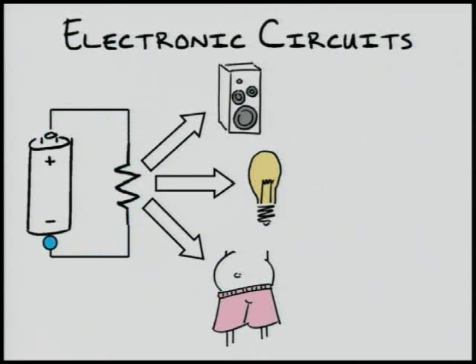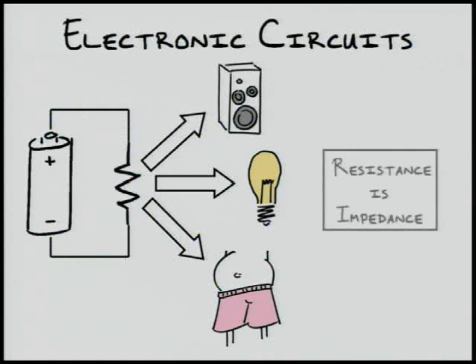The reason being, the charges produced by the neurostimulator must traverse cells or the extracellular space as they exit one electrode of the neurostimulator and enter the other. These pathways are not very conducive to current flow or charge movement and thus resist this phenomenon, which is why they can be considered a resistance or impedance. For the sake of this tutorial, we will use the word impedance rather than resistance to describe this aspect of neurostimulator function.